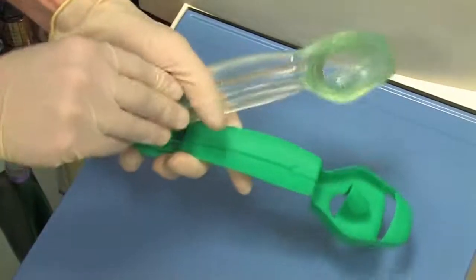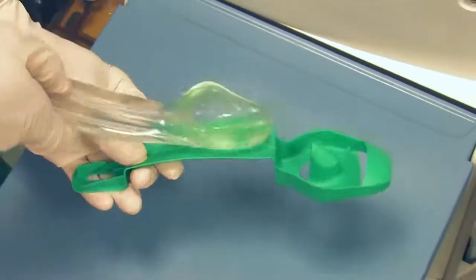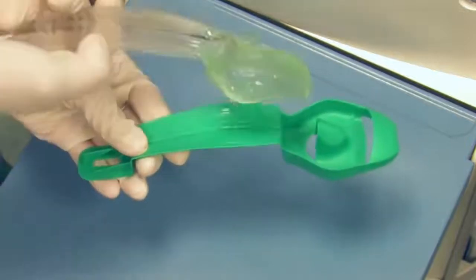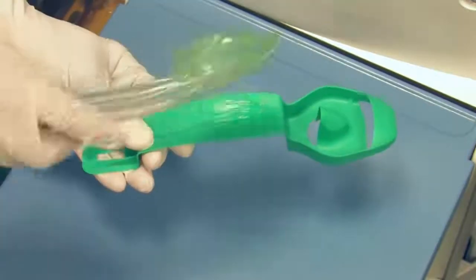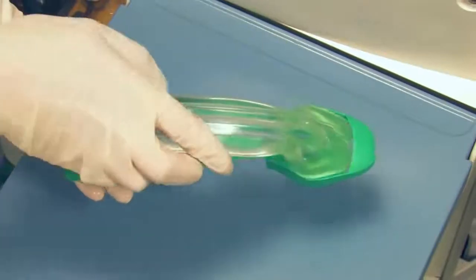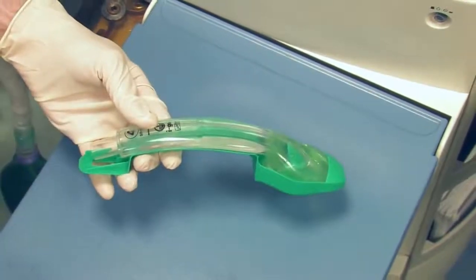In the final minute of oxygenation, the supraglottic airway should be lubricated according to the manufacturer's instructions. With the iGel, it's particularly important that the device is lubricated on all four sides of the cuff, and not just on the tip and posterior surface. Do not use silicone-based lubricants.